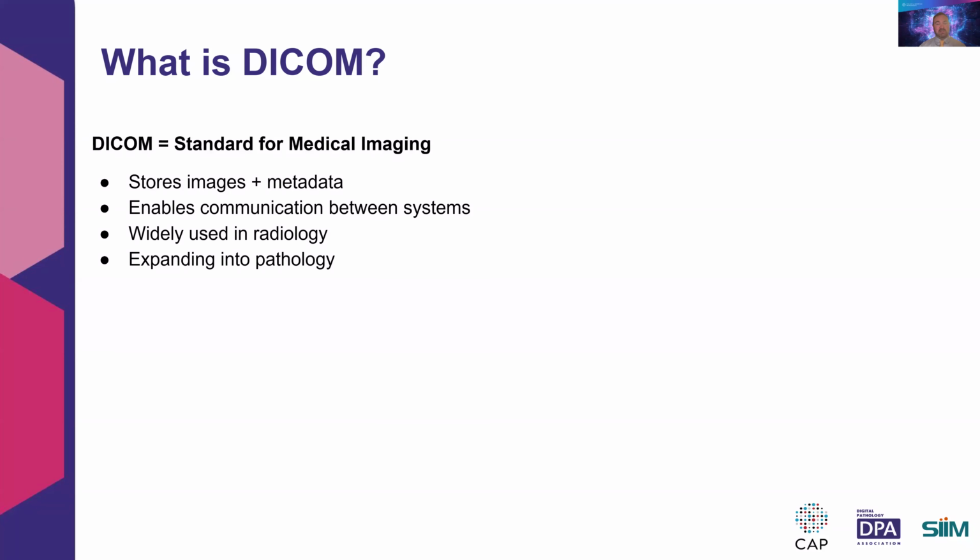So for pathology, though, it's newer to the space, and whole slide images have their own unique characteristics. For one, they're much larger, they're more complex, and historically they've been stored in proprietary formats. Well, we saw that happen in radiology. Pathology is facing the same thing, and so now we're looking to solve this in our own space with DICOM. So DICOM is aiming to bring standardization to our environment.